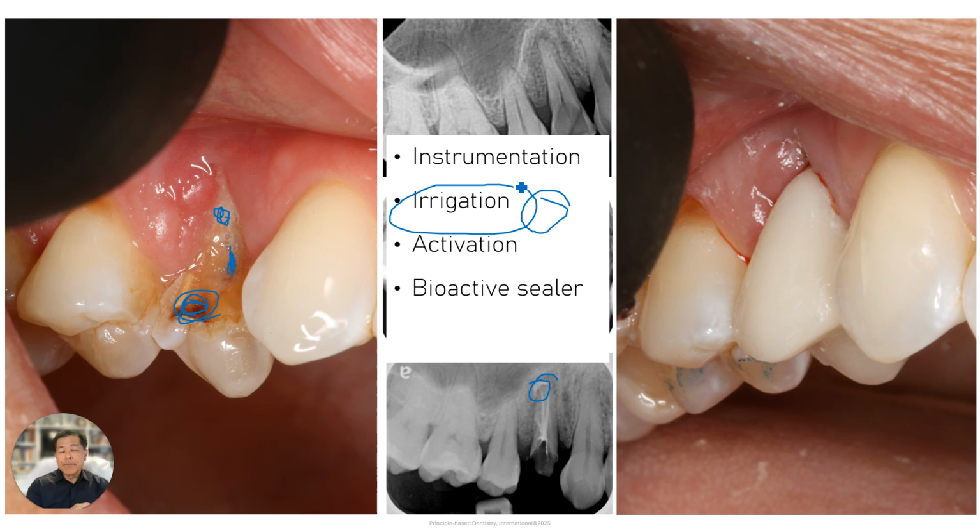Then when I seal this up, I'm using the Regen Bioactive Endodontic Sealer to seal these canals up. What it does, if we do have an overfill up there, it's going to create an alkaline environment. So I saw this patient after this was done this week, and she complained of no discomfort at all. Why? Because it creates an alkaline environment up where the infection used to be, and so there's very little discomfort.